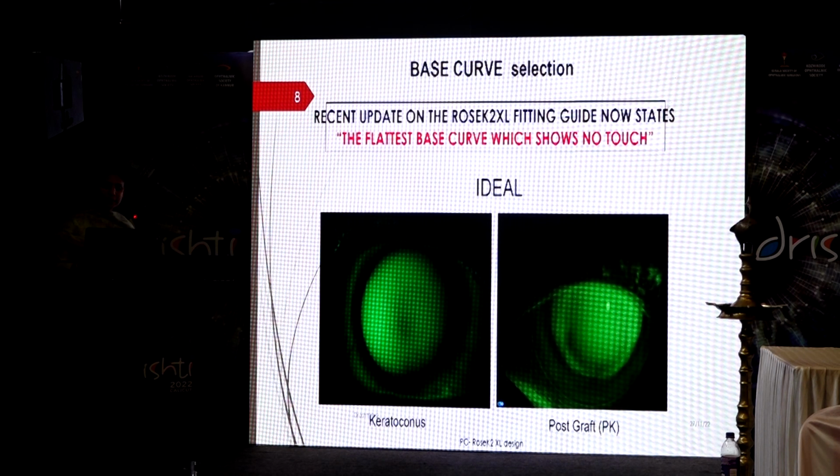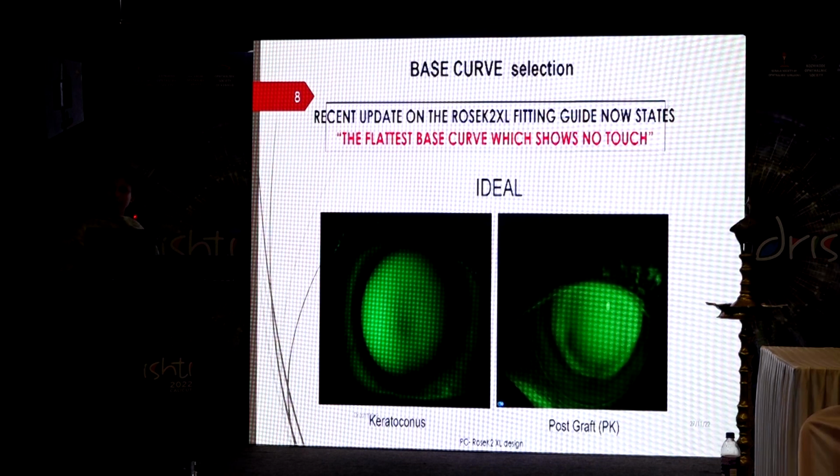So the flattest base curve which shows no touch is the base curve that you need to choose for a corneoscleral lens design. This is not based on the sagittal depth but on the base curve. I am talking about corneoscleral lenses.